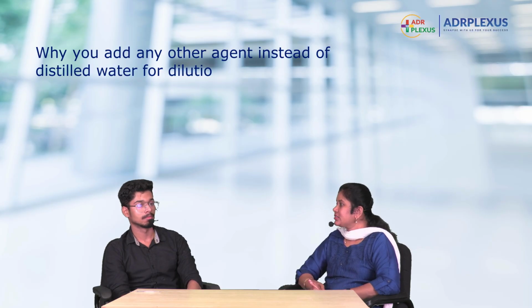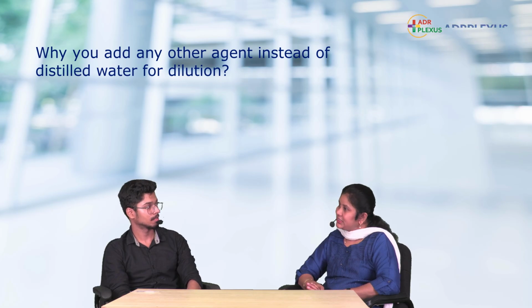Very good. Can you add any other agent instead of distilled water? Buffer solution. Yes, actually buffer solution is the ideal one. But distilled water is easily available and cost effective, so we use distilled water. Fine. Now the smear is done. Staining is done. It is ready to be seen and counted. The number of cells we can identify now under the microscope.